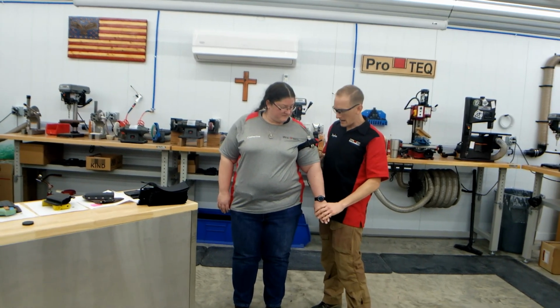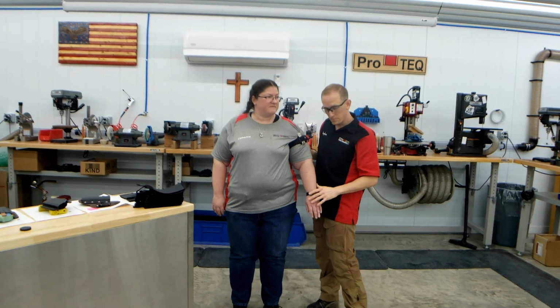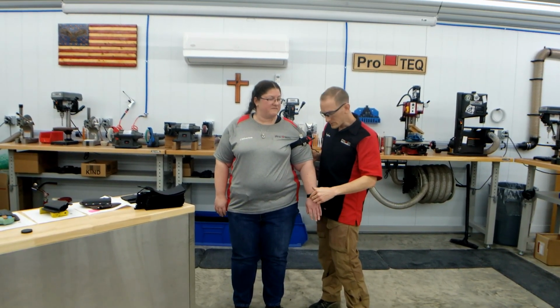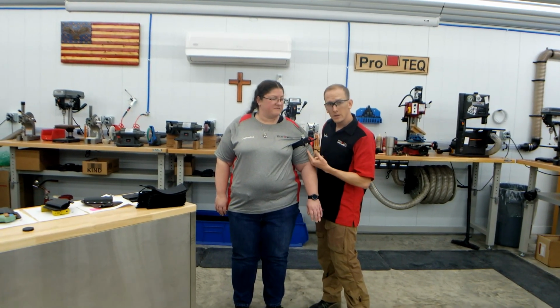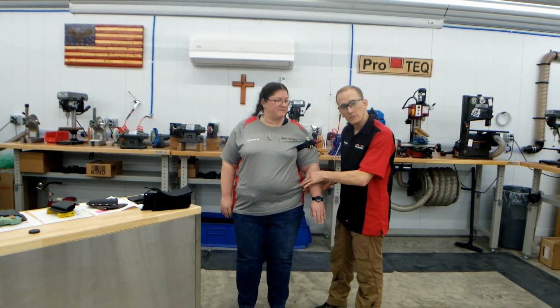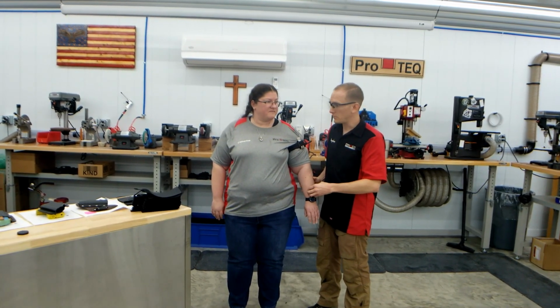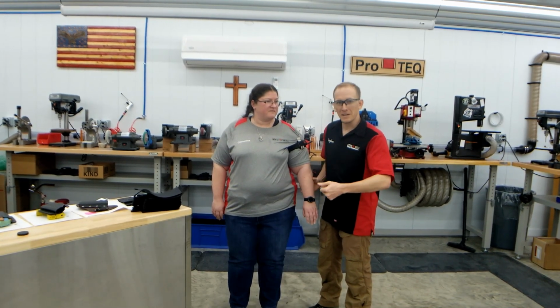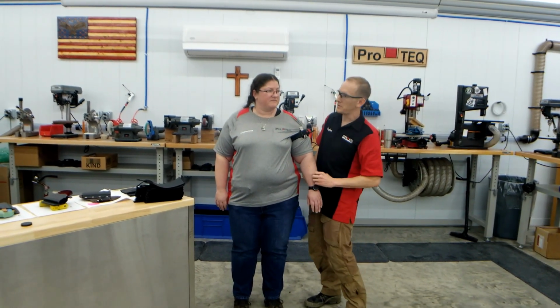Doesn't matter if she got shot in the hand or she got shot right below this or right under it. I'm going to go way high because bullets fragment. They'll hit the bone and they'll fragment. So she might get shot here and a piece of that jacketing might travel a foot or more upstream and nick an artery. Well, if I put the tourniquet 6 inches above the wound, like is taught in some courses for blunt force trauma, like a guy splitting wood who misses and hits his foot, you'd only go 6 or 7 inches above that wound because there are no fragments up there. But with a gunshot wound, you can get fragments. So go high on the limb.